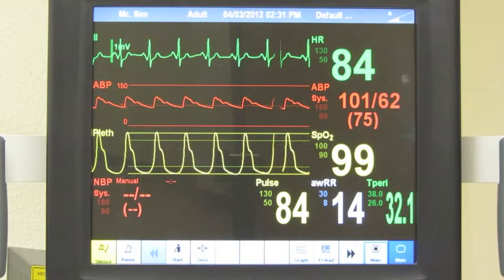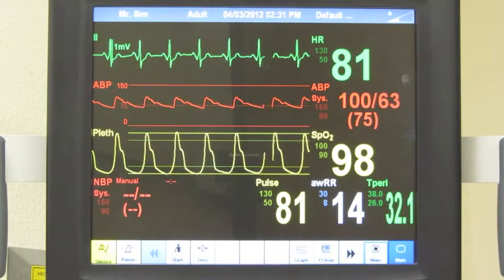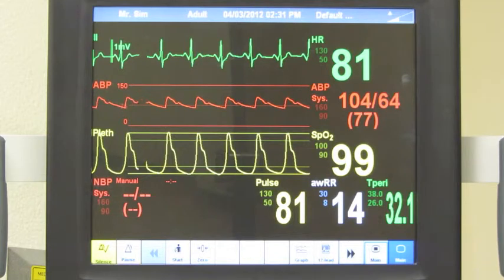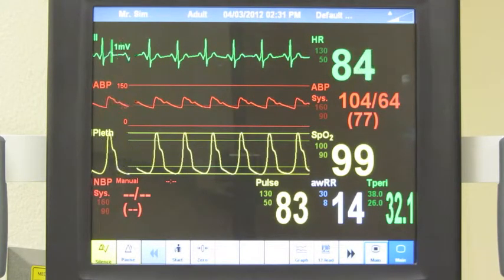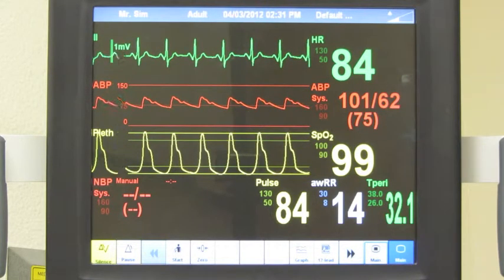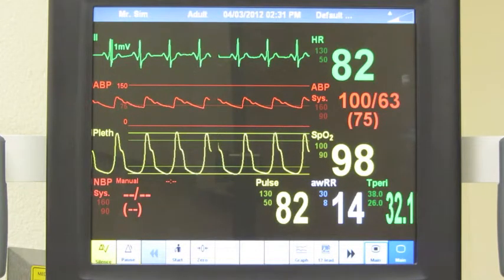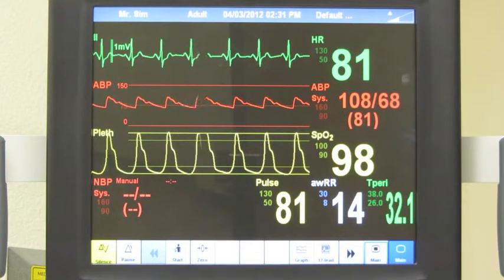All of this information is based on the following assumptions. The ST segment was isoelectric at rest and became depressed during the activity. Assumption number 2: there was an absence of cardiac medication that would alter the response to testing. Such a medication would be digoxin. The third assumption is the absence of metabolic abnormalities during the testing, such as hypokalemia. If these three assumptions are correct and you see a horizontal or downward sloping ST segment as a new finding, that should be cause to discontinue the activity.